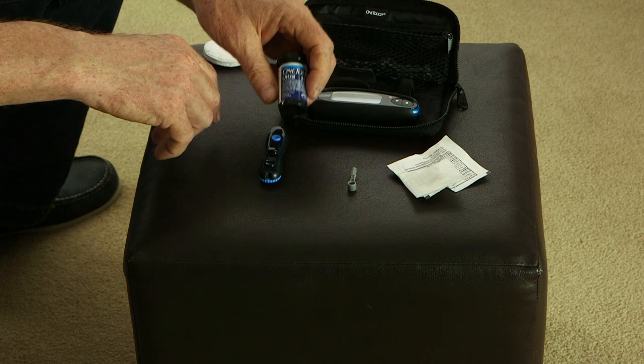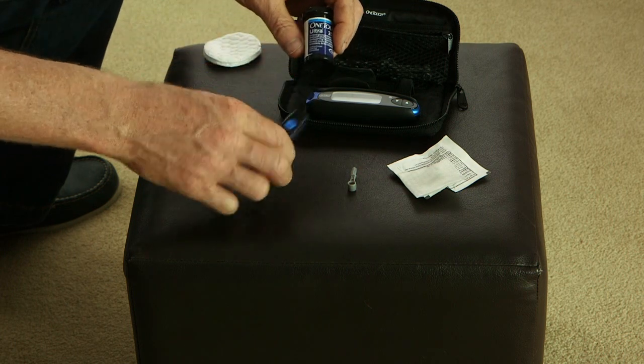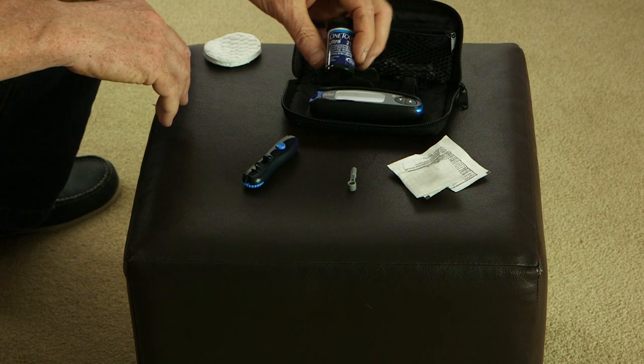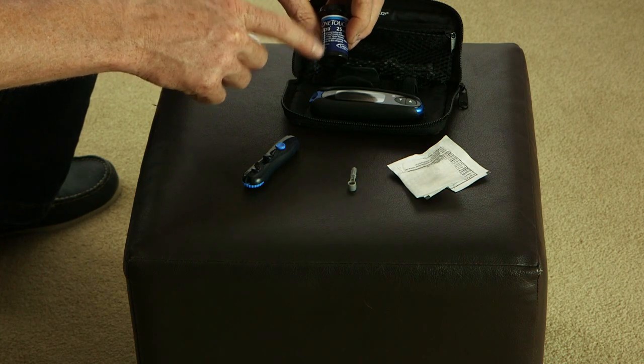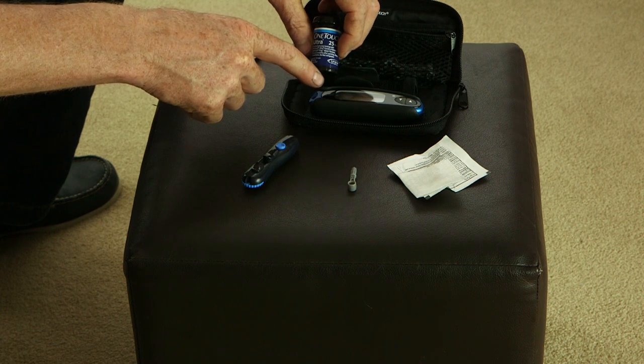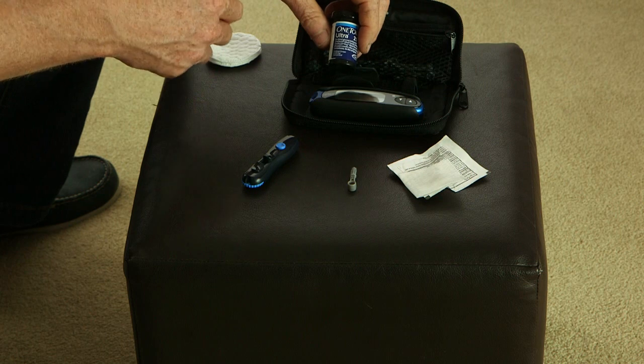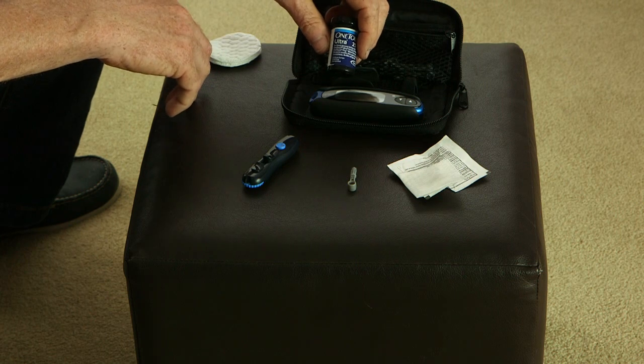If you're really pricing them out, price based upon the slides, not based on the unit. They pretty much give away the unit just so they know you're going to buy the slides afterwards. But make sure they are compatible. In most cases, when they are compatible, you can just put in a slide and the unit will know which slide it is. It will automatically calibrate. There's nothing past that you have to do.